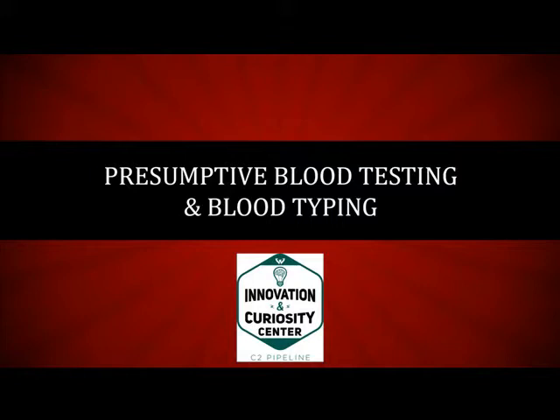Welcome to the C2 Pipeline Innovation and Curiosity Center Presumptive Blood Testing and Blood Typing Lab.